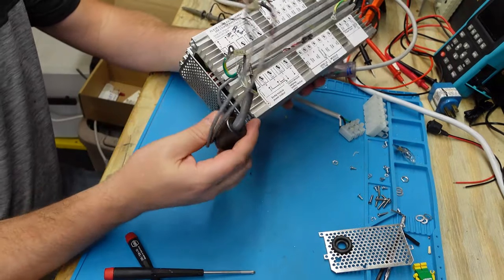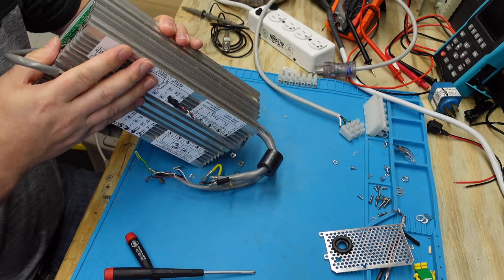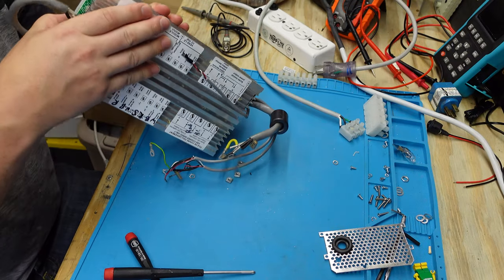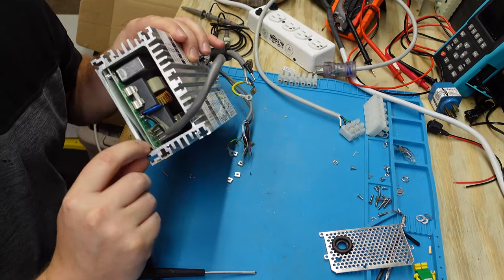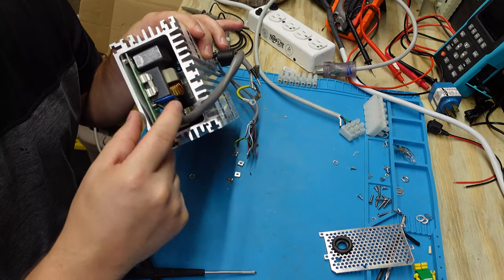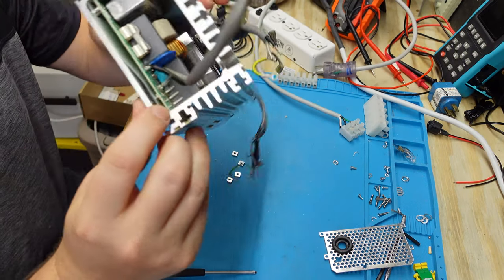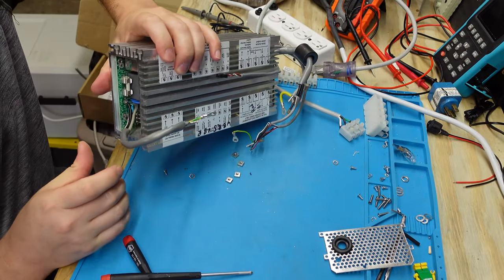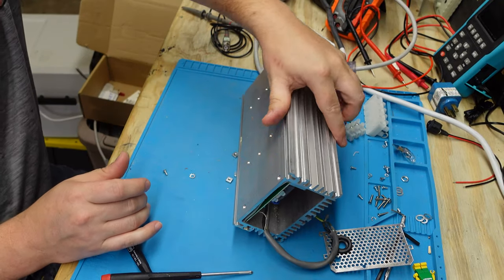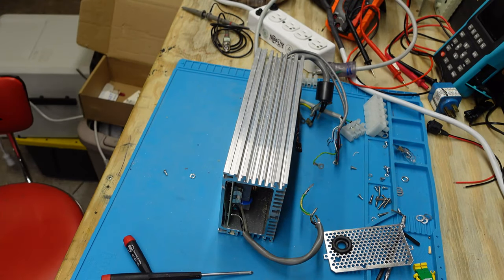Okay. So since this one has more cables and I don't want to goof around with this choke, I'm just going to slide the whole entire PCB out that side. And, wow. I can tell right off the bat that my bridge rectifier, which is a beefy little guy, that one is coupled to the side because it's screwed in. So I wonder if the other ones are mounted on the underside of the board too. You can see them right there. Let me guess, it's not going to come out that easily. All right. Have to revert to dead blow.